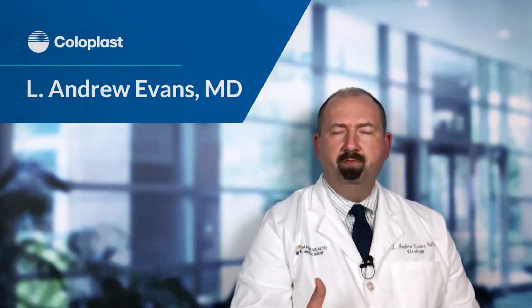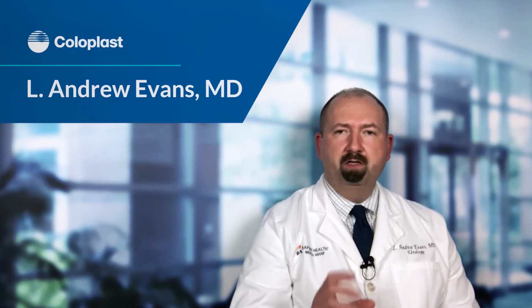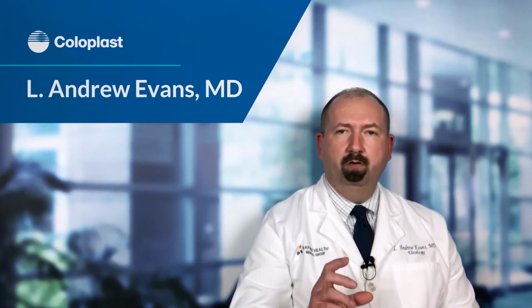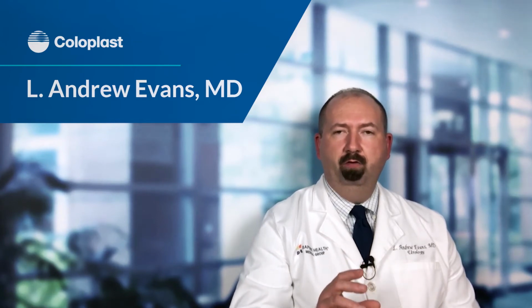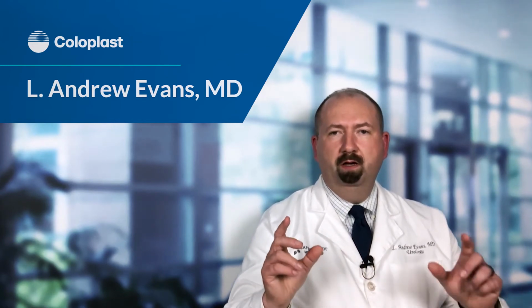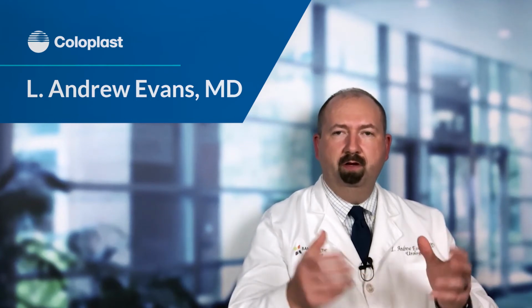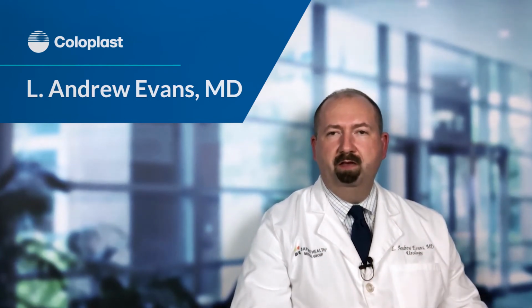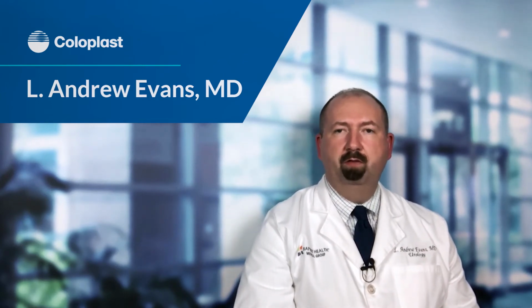A male sling is performed as a straightforward outpatient procedure. We make a small incision behind the scrotum that allows the urethra to be identified. We'll make a couple of small entry points on the inside of the thighs that allows the obturator sling to be placed in a safe manner to restore that support to the urethra after prostate removal.